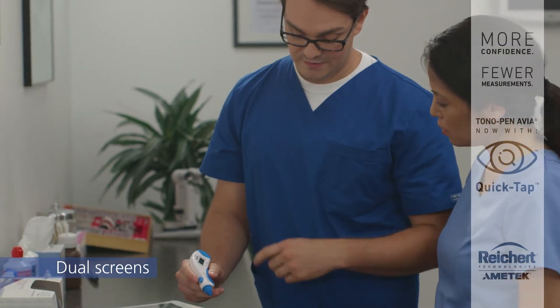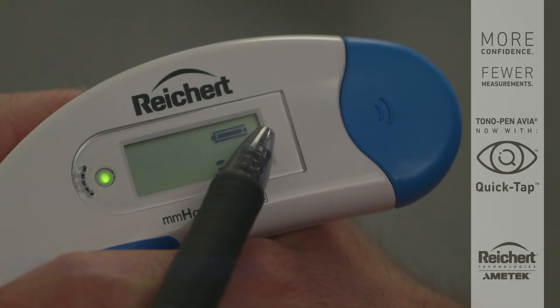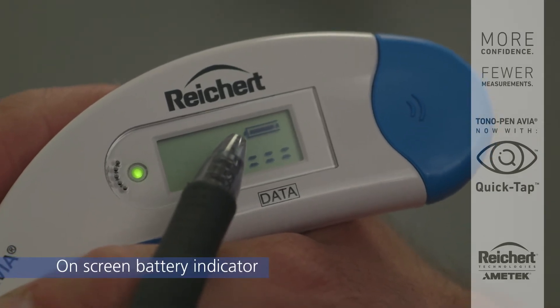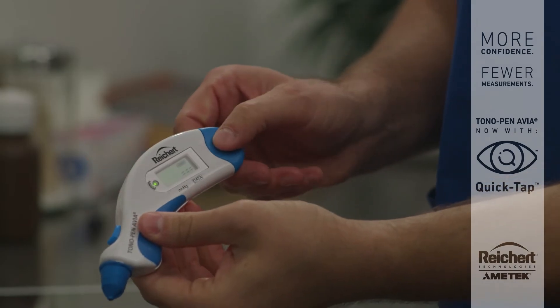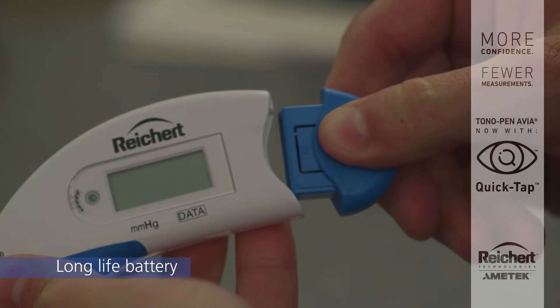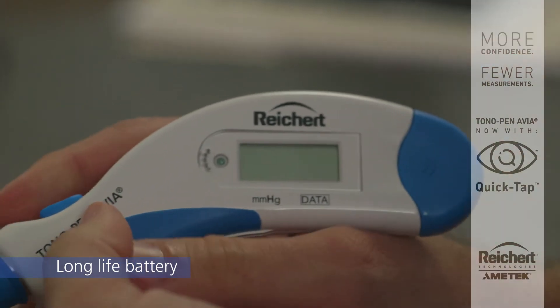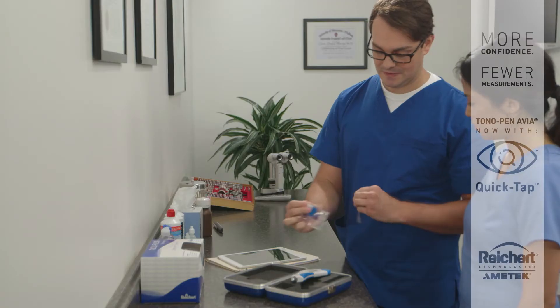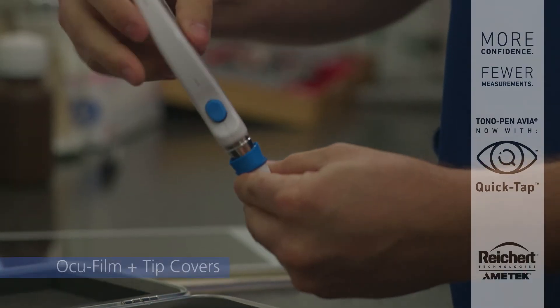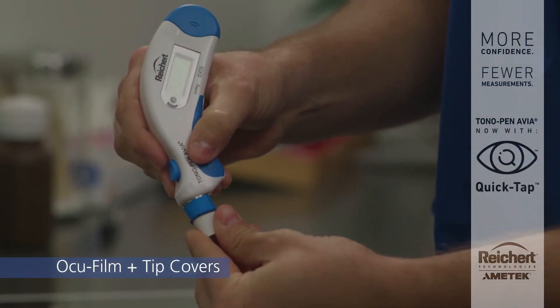The convenient on-screen battery indicator ensures that Tonopan Avia will always be ready for use. The removable Tonopan Avia PowerCell battery pack is easily replaced, requiring no tools — just squeeze and pull. Disposable and affordable single-use sanitized Riker Occufilm Plus tip covers protect your Tonopan and are easy to apply.